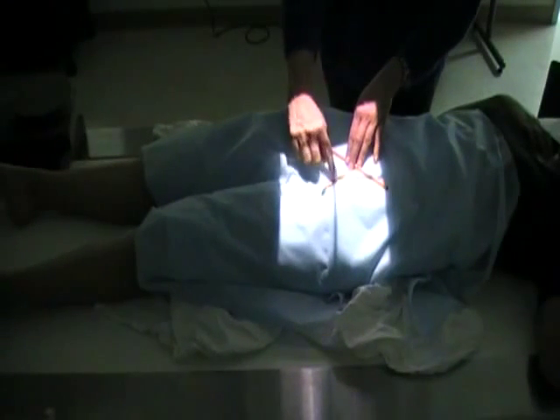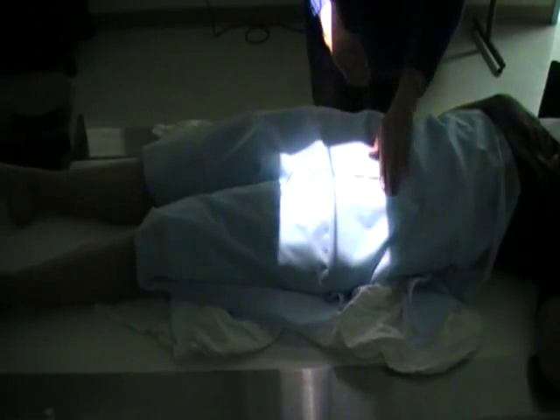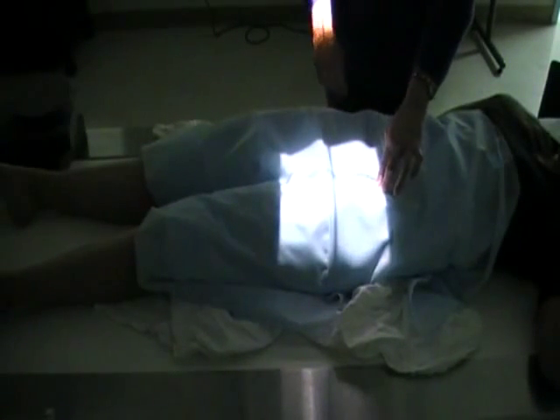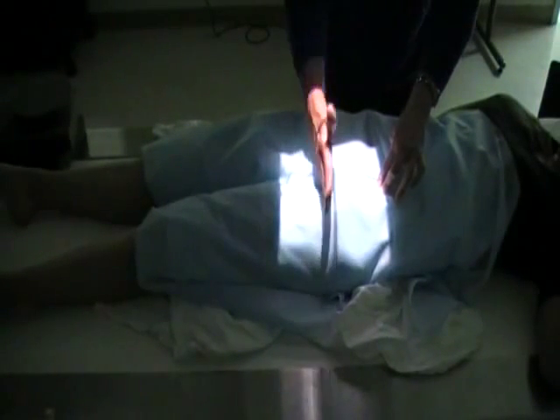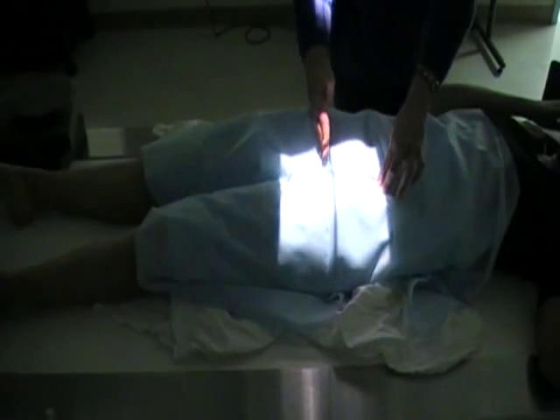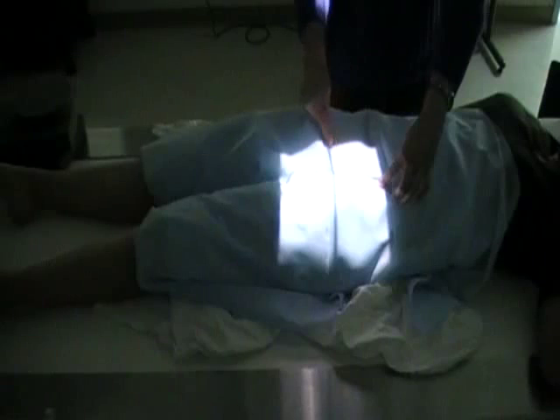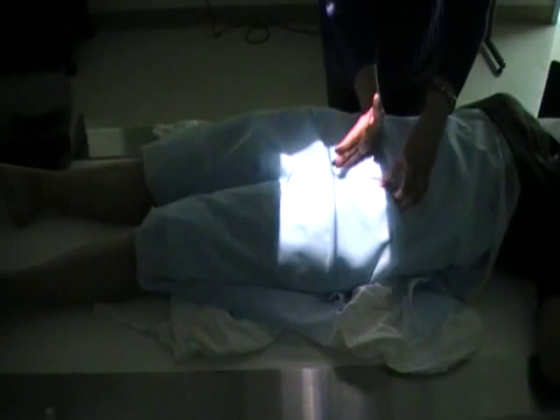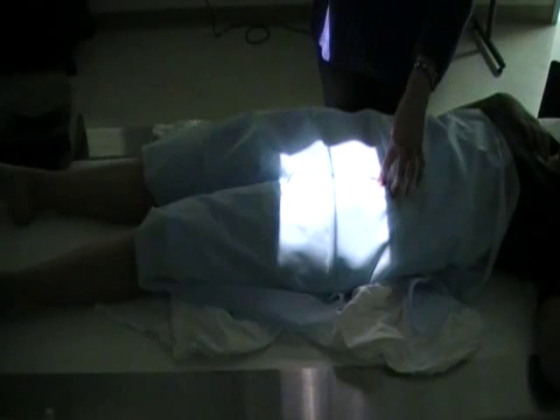So I want to be over the neck of the femur, so I'm centered right at the area I want to be at. So again, palpate ASIS. The pubic symphysis bone is going to be at the same level as the greater trochanter prominence. Okay, so you have these 2 points. Draw your imaginary line and go down perpendicular from that to have your central ray area.